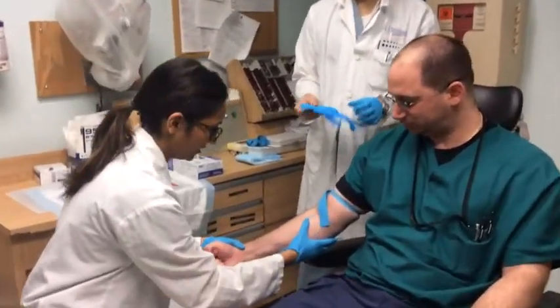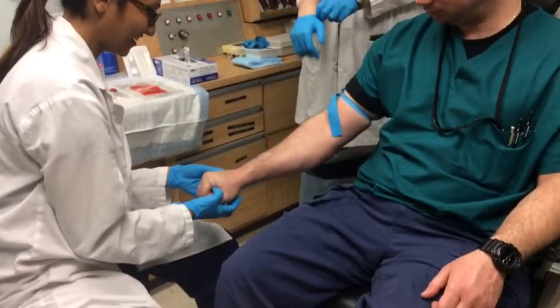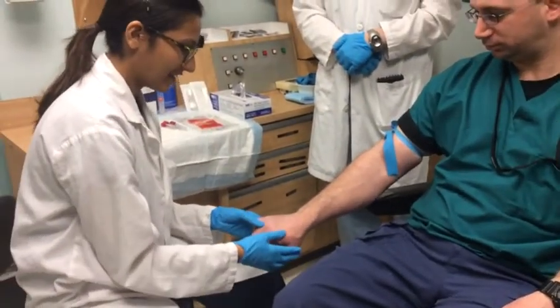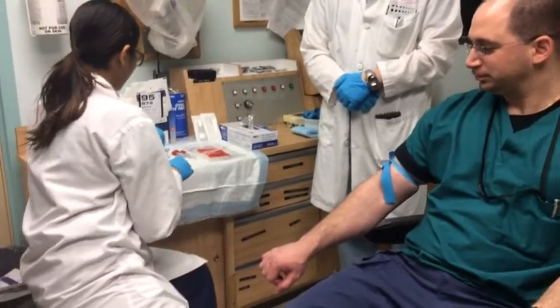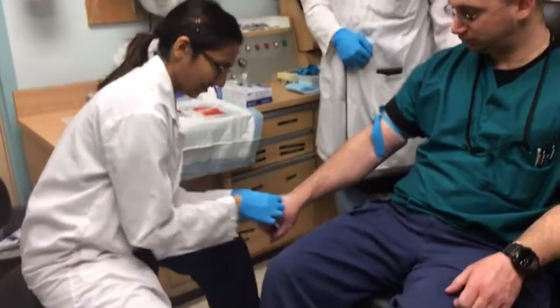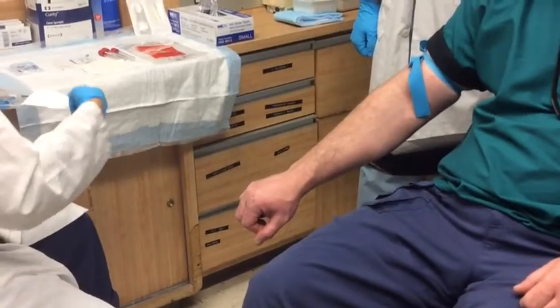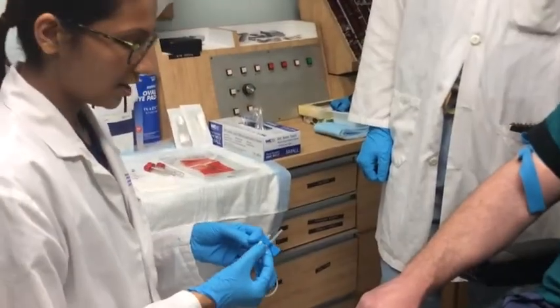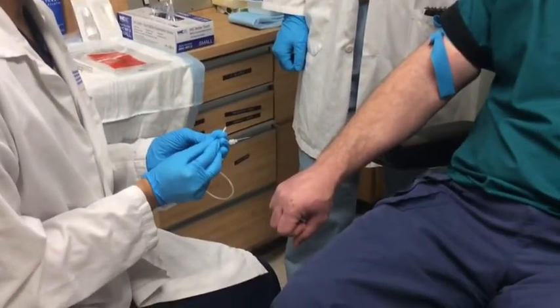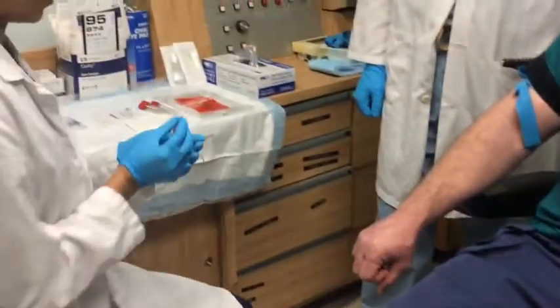Let's see — I'm going to look for some easy access here. We could go up here, but I think I'm really liking these veins in your hand. So we're going to go ahead and clean that area. Very good veins here. We have our vacutainer, 25 gauge. We're going to hold the butterfly part of it, take the cover off, and expose the needle.